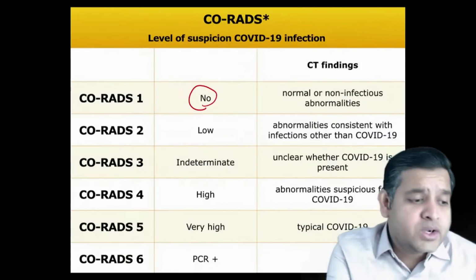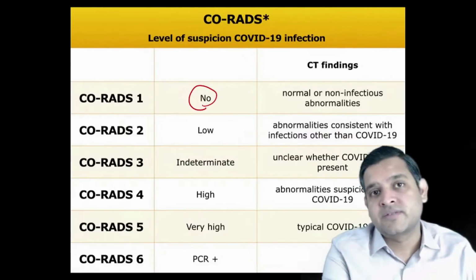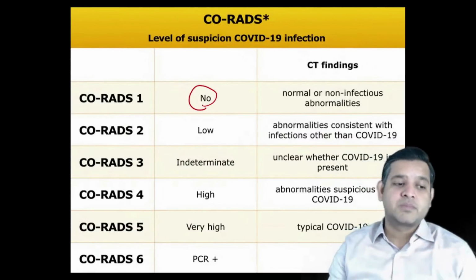CORAD 2 means that there are changes in the CT which are favoring some other infection.